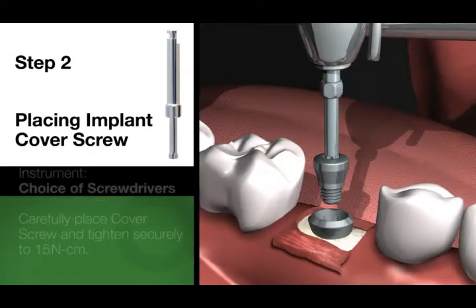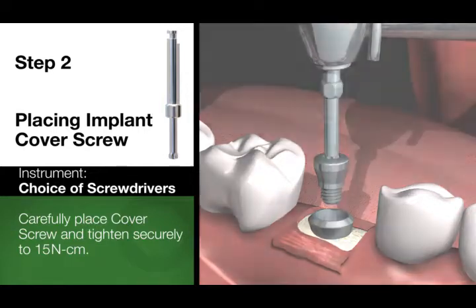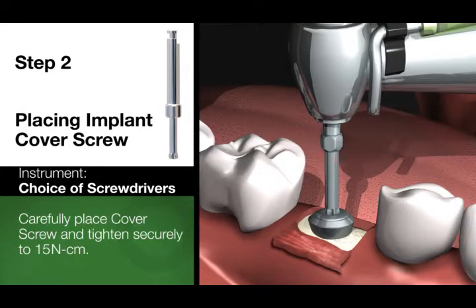Step 2. Placing the implant cover screw. Engage the screwdriver with the top of your cover screw and screw into the top of the implant using the recommended torque of 15 Newton-centimeters.